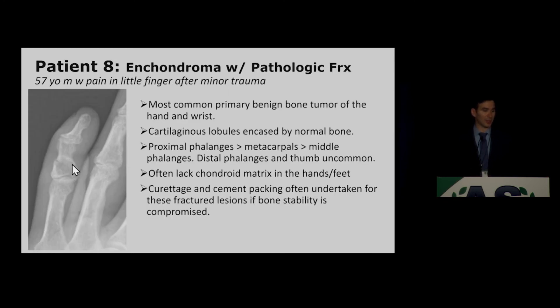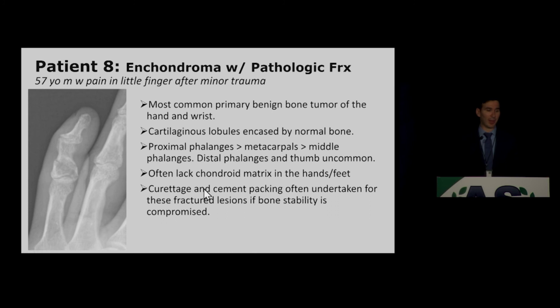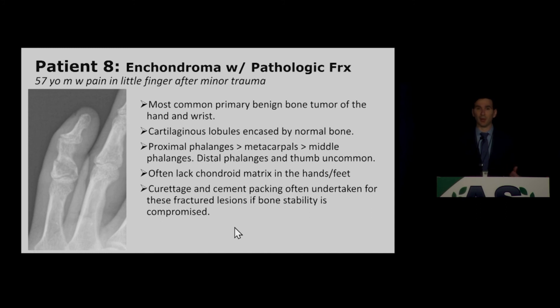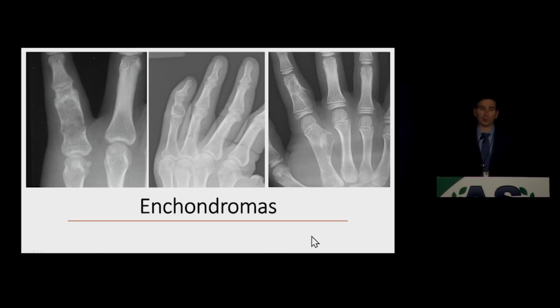Patient 8 has a lytic lesion with no appreciable internal matrix — an enchondroma with a pathologic fracture. In the hands and feet, enchondromas often lack cartilaginous matrix, can be very expansile, and can thin the cortex. Unlike enchondromas elsewhere in the body, cortical thinning or scalloping in the hands and feet is not an indicator of malignant transformation. Some lesions that repeatedly thin bone and cause pathologic fractures are treated with curettage and cement packing. Very eccentric lesions may be called juxtacortical or subcortical chondromas.